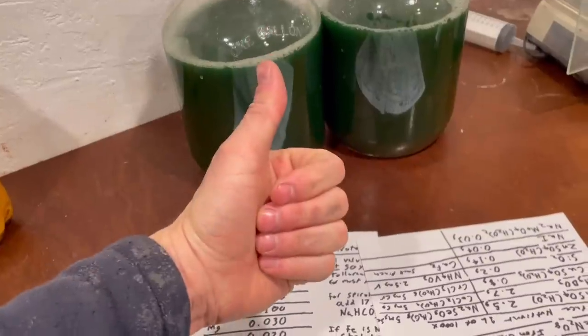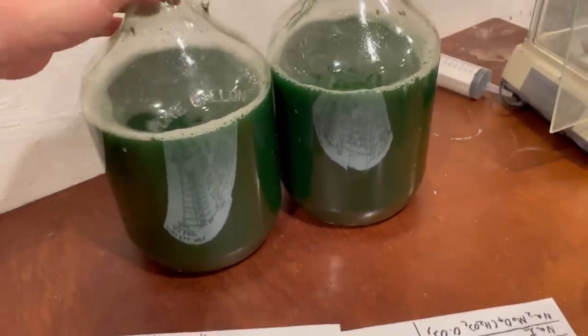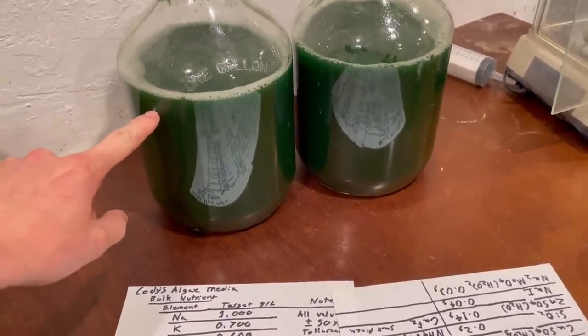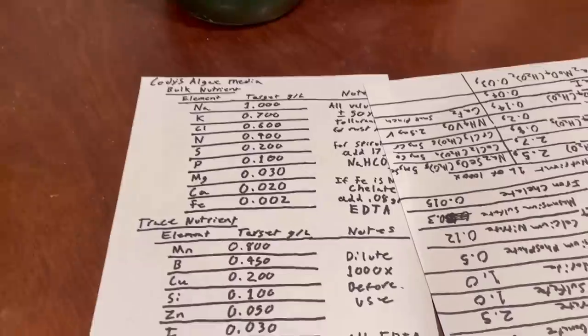Welcome back to Cody's lab. I wanted to do a bit of an update video on the algae media. You can see the algae is doing fine — it's alive and well — and I'm just about ready to expand the culture again, but before I do that I need to make a note of a few things.